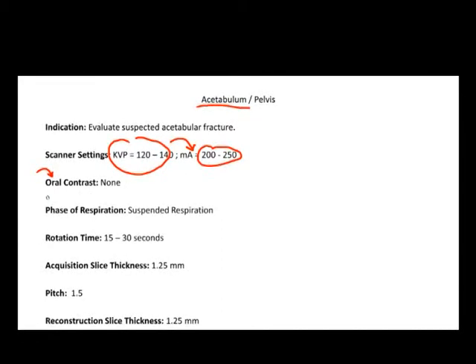Oral contrast is not going to be utilized. The phase of respiration is going to be suspended respiration due to the fact that breathing, even though you're going through a very, very shallow portion probably of the patient's anatomy, you still don't want to have any kind of motion if you can help it, because it could obscure or make there be a fracture where there is nothing, or make it look like no fracture when there is.